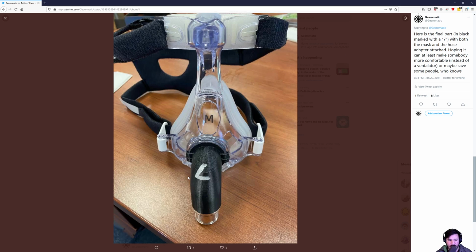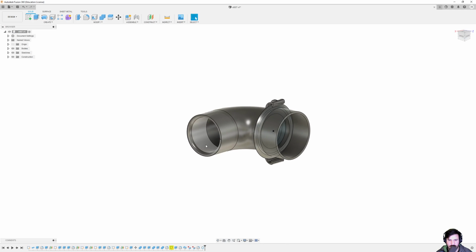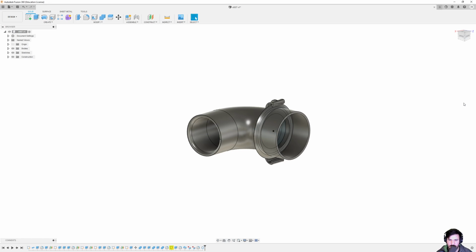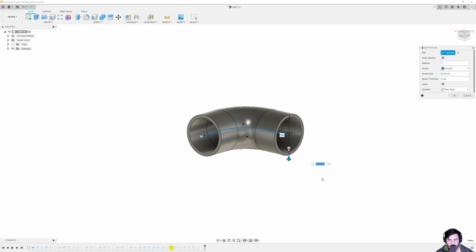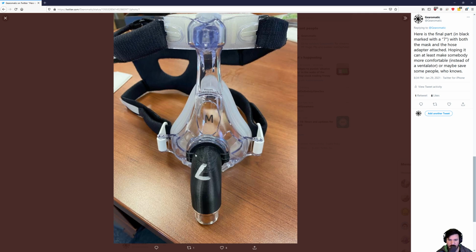I had a 7A and a 7B as well. 7A was exactly the same. It's just this inside diameter. I had gone into here, and instead of it being 26.5, it was 26.25, which is just a tiny bit smaller. And then I had a version that was 26.75, which was a little bit bigger than 7. And that allowed us to try and get this plastic piece on the bottom here press fit properly. It turns out 7 was right on the money.